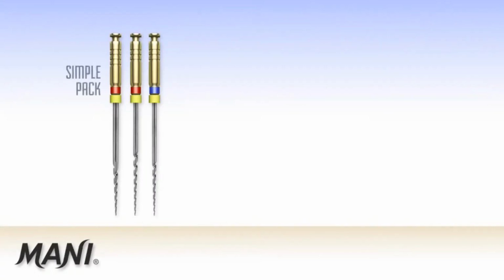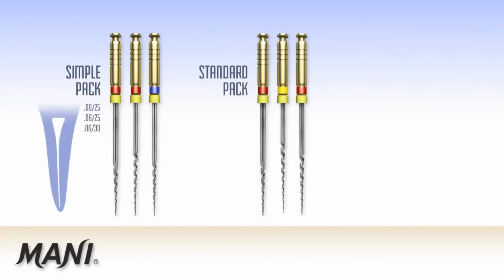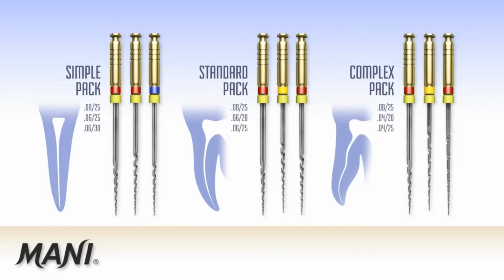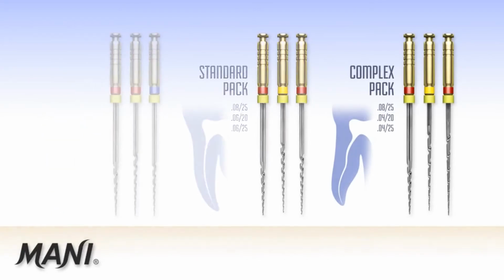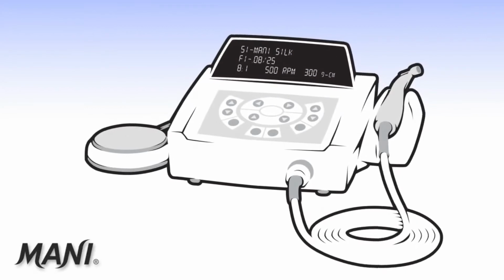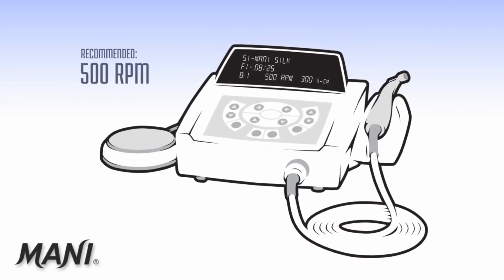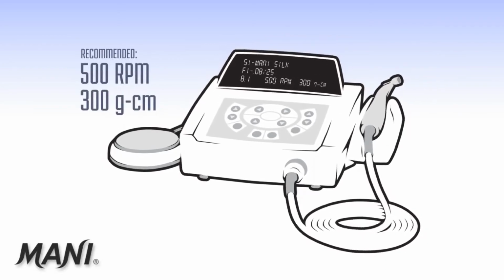The Mani Silk Simple Pack configuration is used in straight canals. The Standard Pack configuration is used in canals with mild curvature, and the Complex Pack configuration is used in canals with moderate to severe curvature and calcification. Any endodontic motor can be used to power Mani Silk. 500 RPM is recommended with a torque setting of 300 gram centimeters.